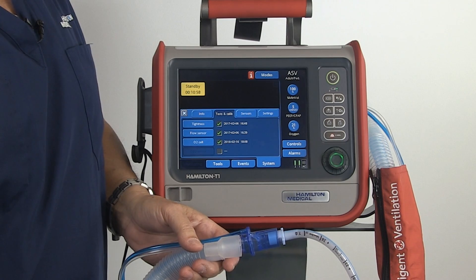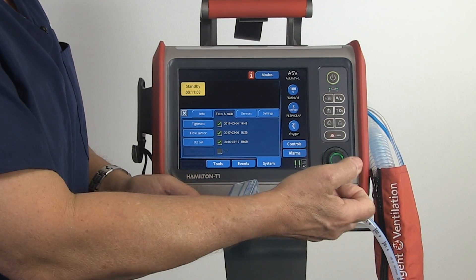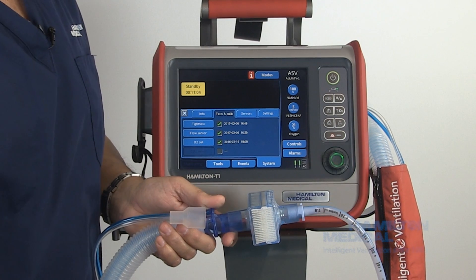After passing your pre-op checks, you're ready now to set your controls, place your filter in line, and begin ventilation.